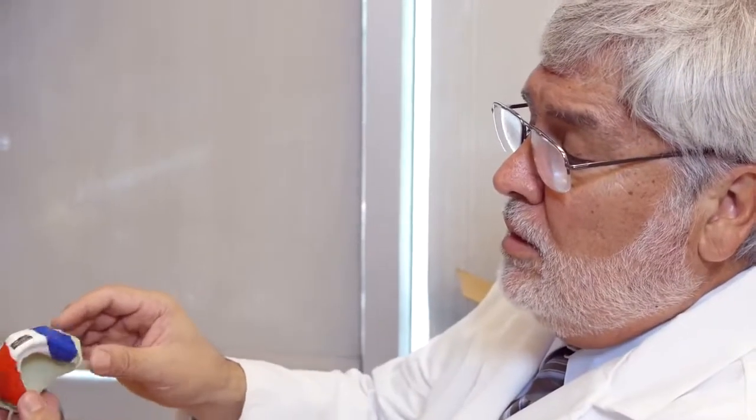Now I'm going to place a name on here, the athlete's name. You can also do an expiration date. You can also do your own office logo, your own office phone number for marketing purposes. But for this demonstration, I'm simply going to put the athlete's name here. Now we're ready for our second layer. The logo is placed and glued.